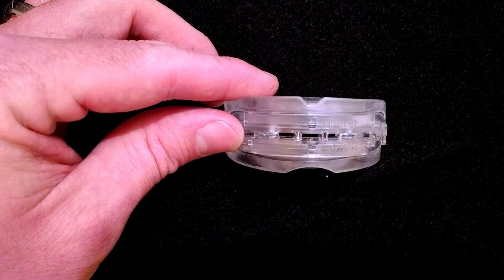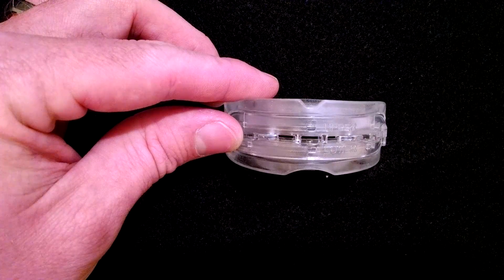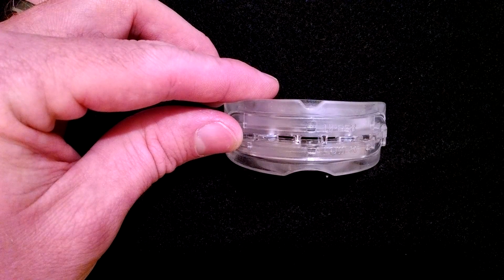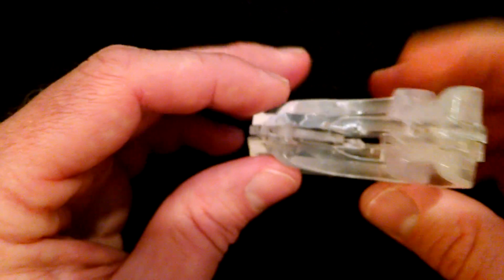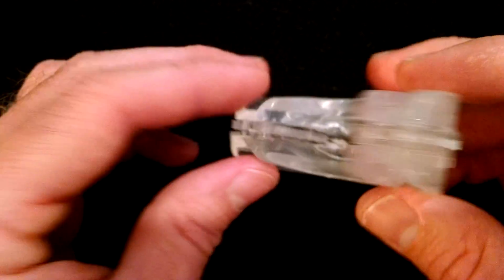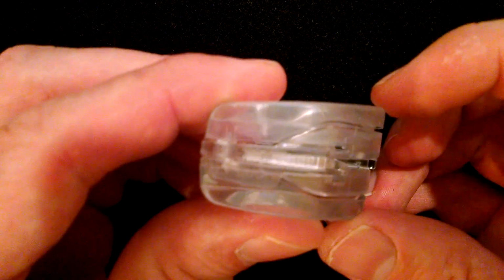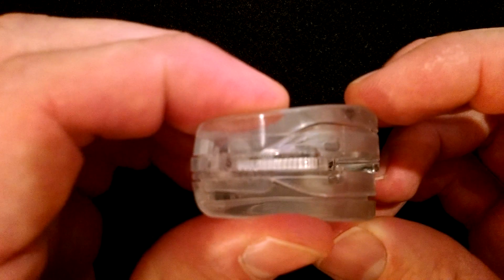At the end of 30 seconds, you remove it and drop it into a bowl of cold water for 60 seconds, and that's going to set the mold. You check the fit, and if you didn't have a very good fit, you can always go back and redo the process at least a couple times. As far as design, this product is actually 2 pieces. There's an upper and lower tray. Each tray has a hard plastic frame in the middle, and on the outside it has a soft thermoplastic material. When you heat it, it becomes very soft, and then it takes an impression of your teeth.